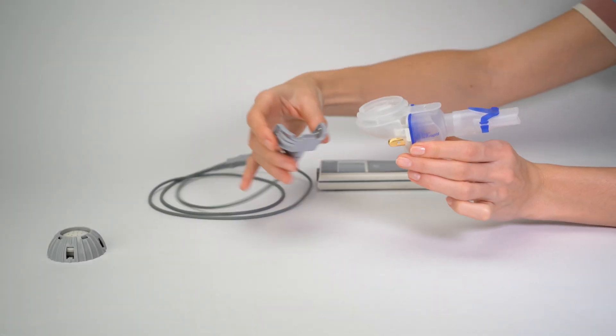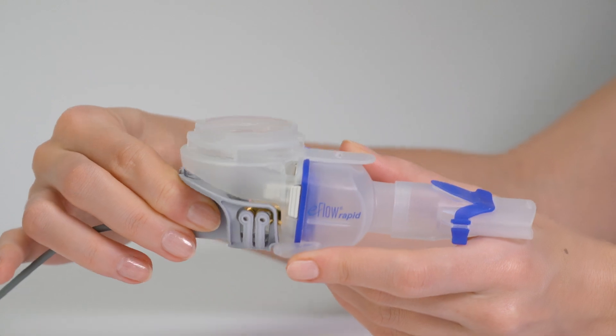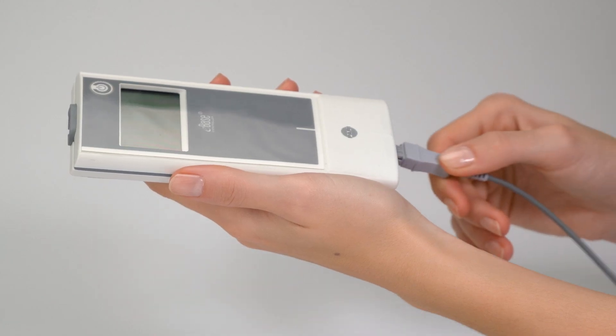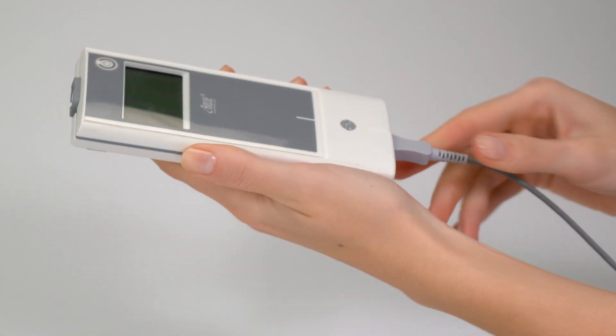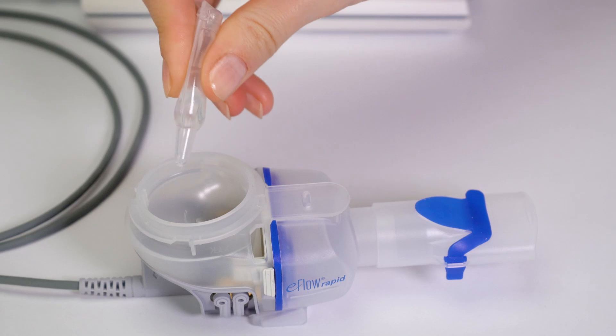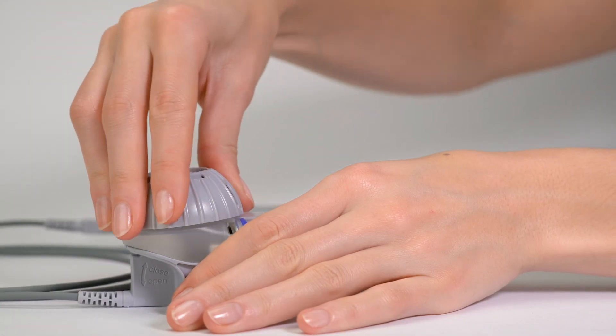Connect the nebulizer handset and controller with the connection cord. The controller can be powered by either the integrated battery pack or power supply. Now add the inhalation solution or medication and attach the medication cap.